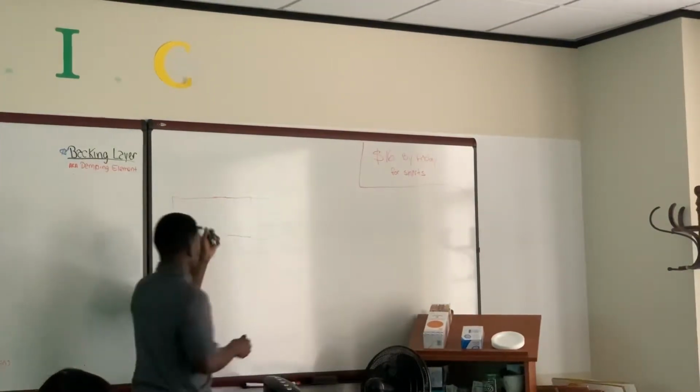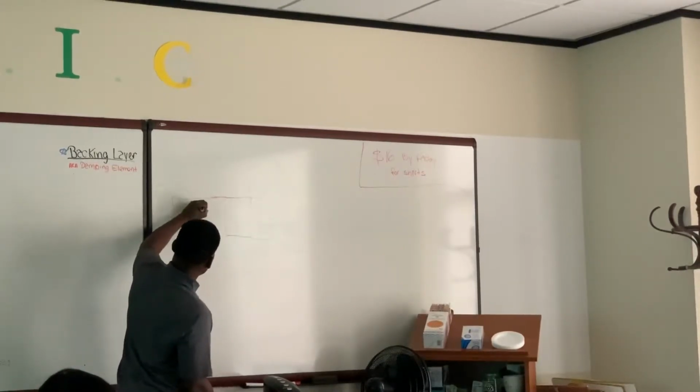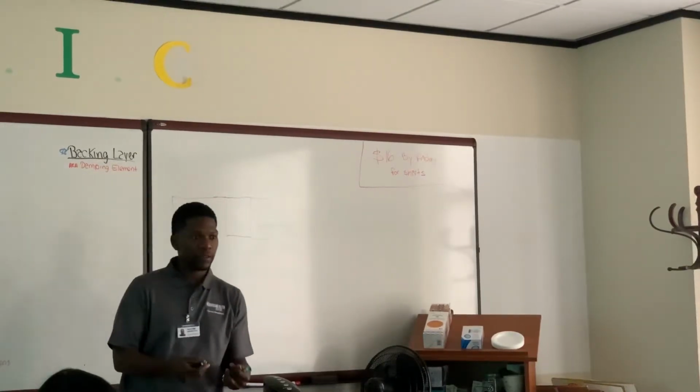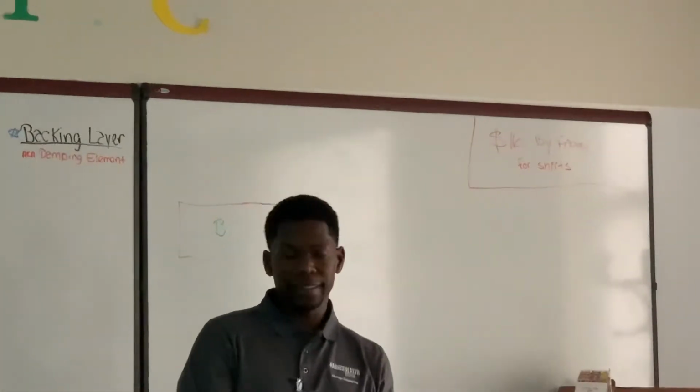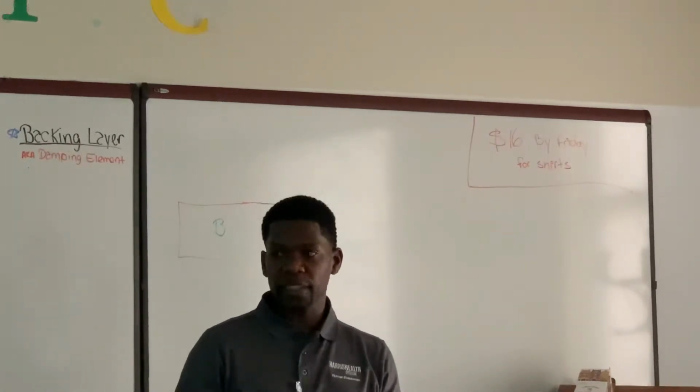This layer right here, guys, that's our backing layer. Our backing is going to put a B for it. Backing layer, or our damping element. It's dampening the sound vibrations created by the PZT. Okay? It's dampening so we can receive and get those reflected sound waves.